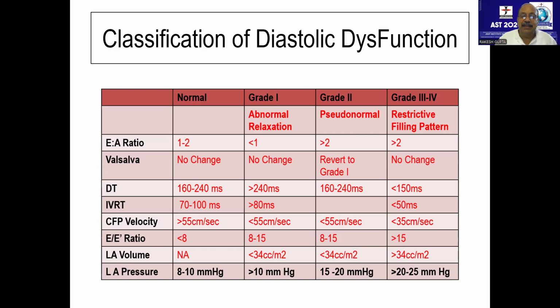If I've got very high blood pressure, my diastolic filling from LA to LV will get hampered. And that diastolic function evaluation is done by looking at the E/A ratio, E prime average, and LA volume index with TR jet velocity. Clear? Yes, sir. Okay, go ahead. Ask me the question.